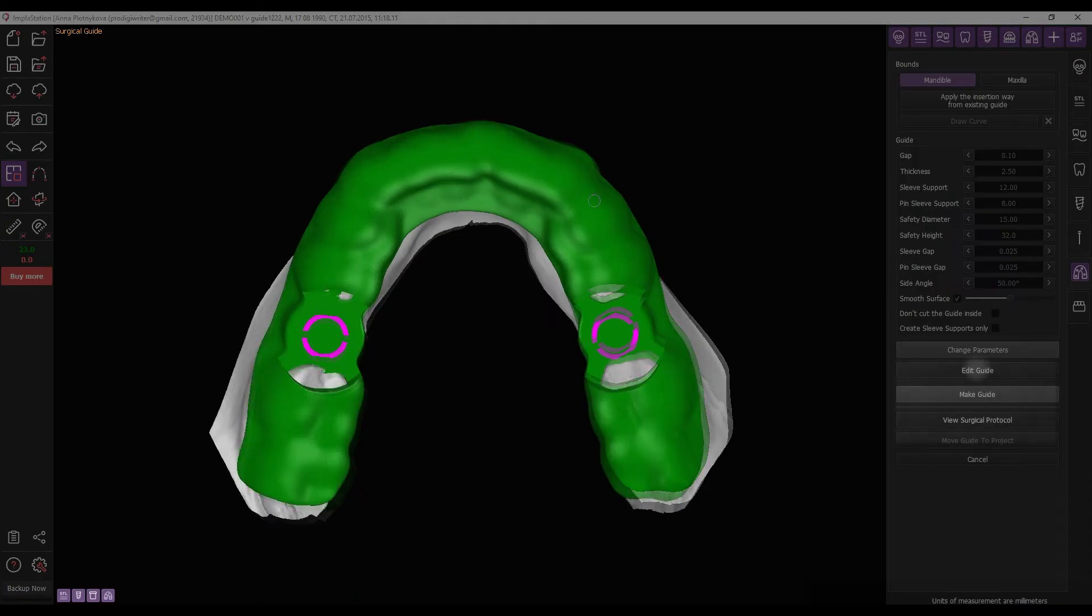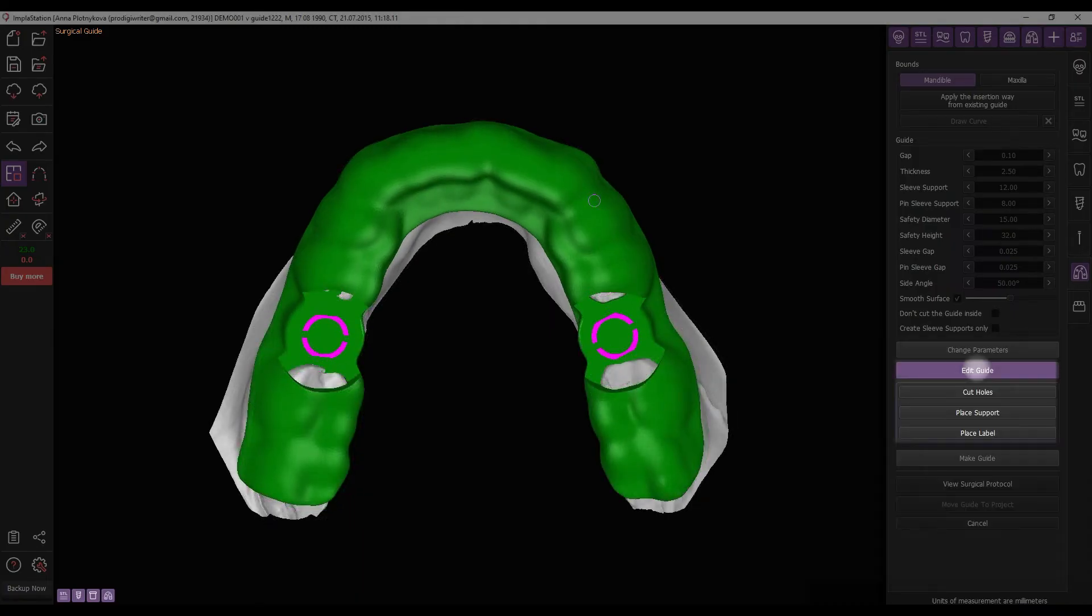The Edit button provides access to options – Cut Holes, Place Support, and Place Label.